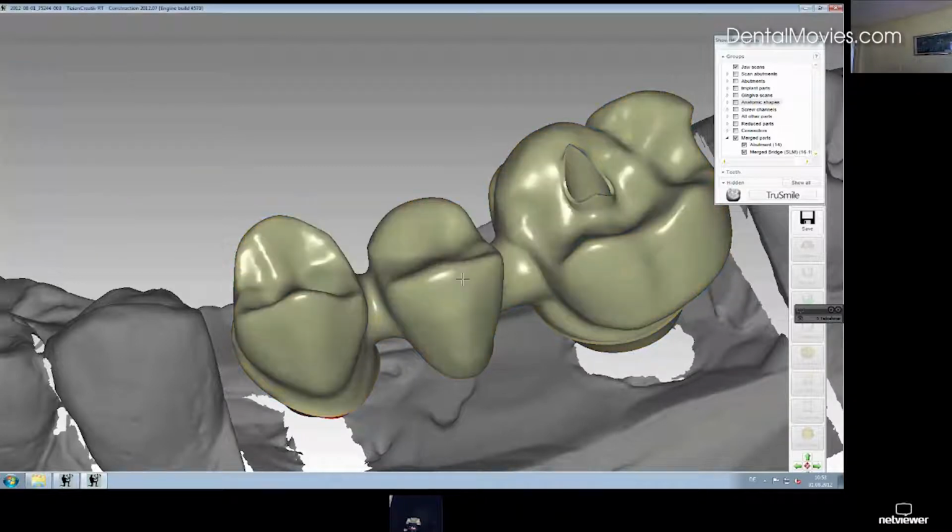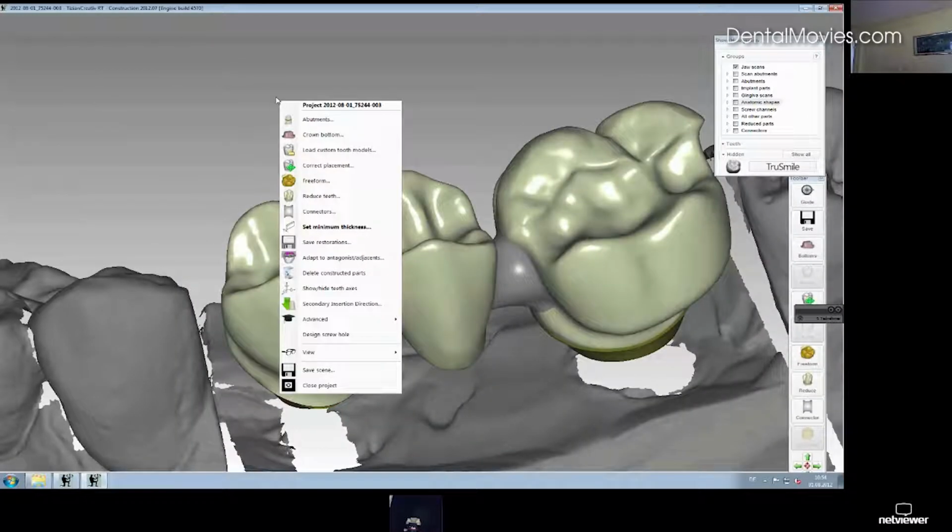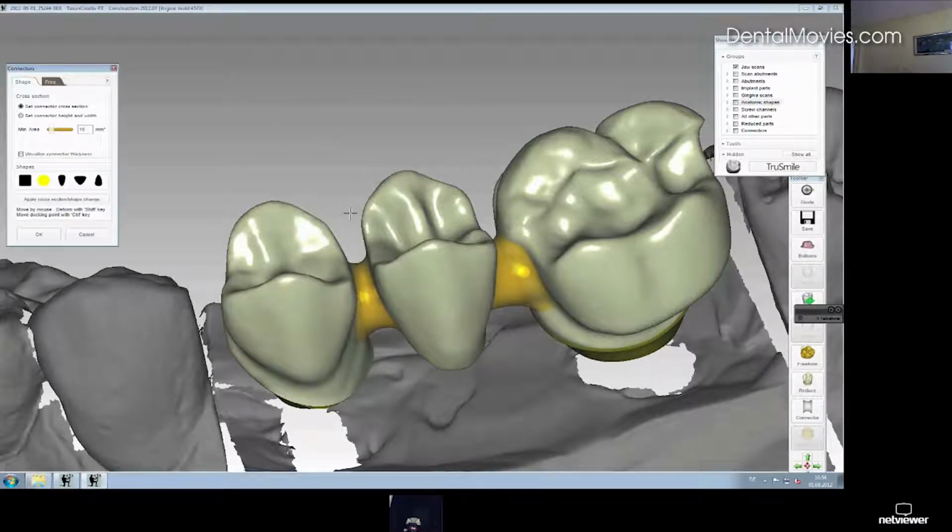Freeform this area. And when you click here on OK, the complete change is getting into the new framework. And here is the new construction with the changes. Or otherwise you delete the complete parts.